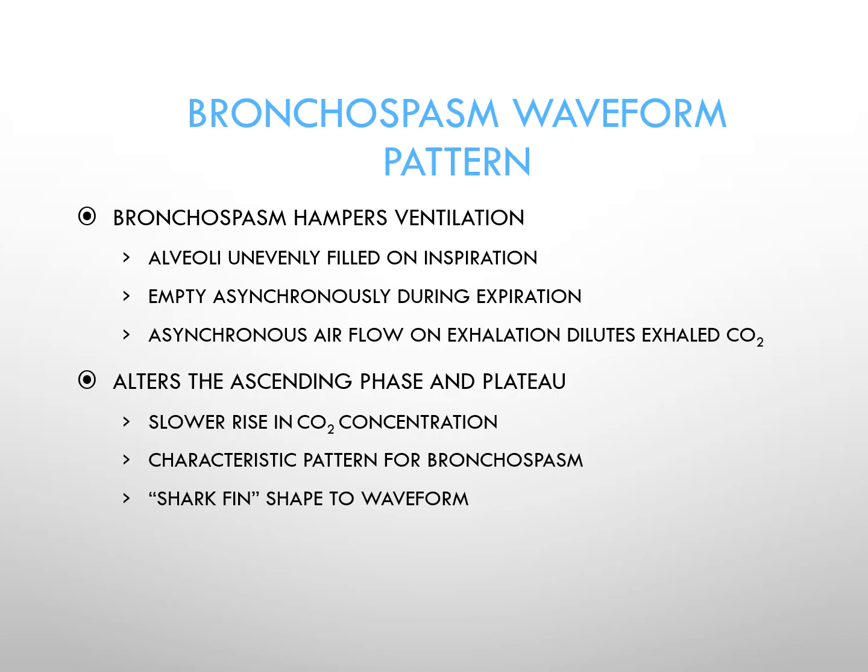So you get this asynchronous airflow on exhalation, which dilutes the exhaled CO2. What it ends up doing is altering the ascending phase and the plateau, so you have a slower rise in CO2 concentration. You get the characteristic pattern which typifies a bronchospasm, and it's crudely referred to as a shark fin shape to the waveform.